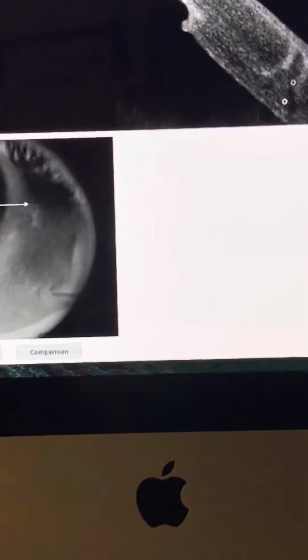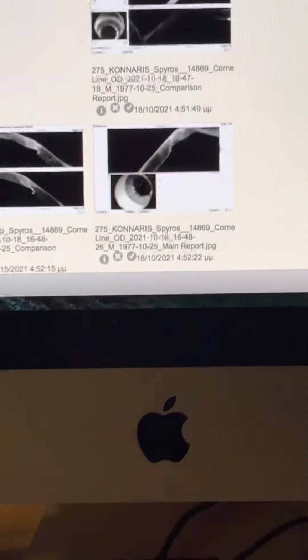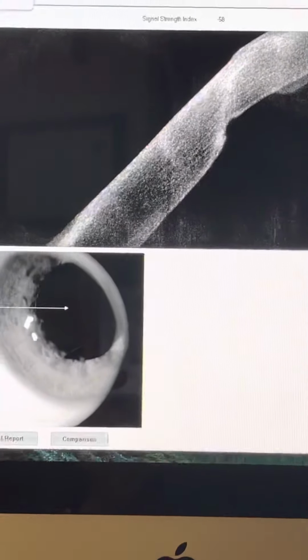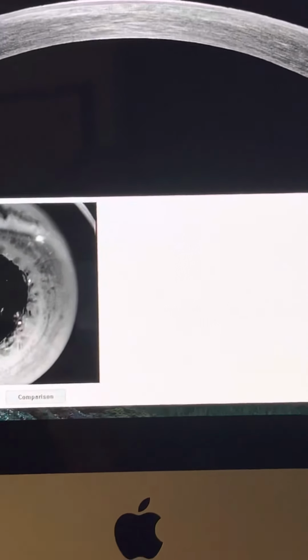So, in summary, and now close with going back to those dehisced areas and how now they have been resutured and they've been brought back together. This is, of course, the 3 o'clock position. That's not that critical, but if I look here, I can see how this area has been approximated. Again, same images of that same area. We'll look at the superior cornea resutured here, and we're gonna try and find, this is the 9 o'clock position again, graft-host interface, and how with the resuturing, we have a better approximation of the graft.